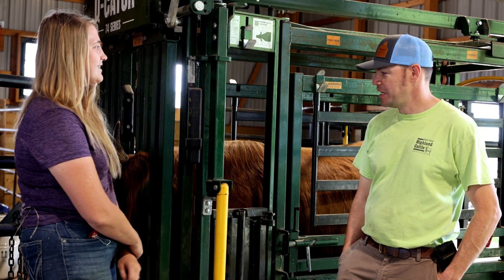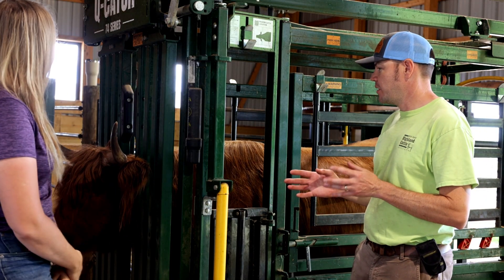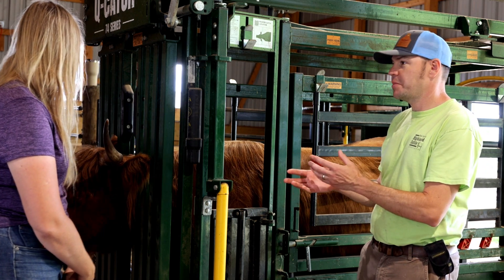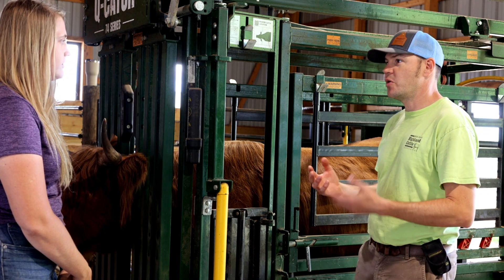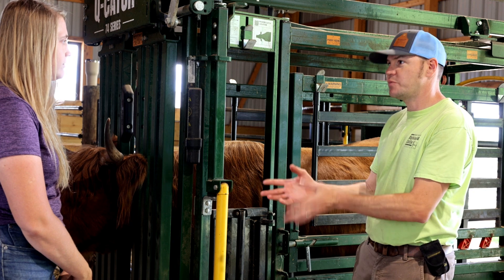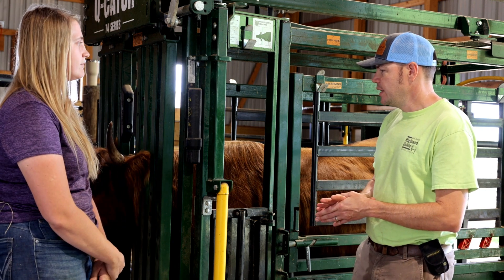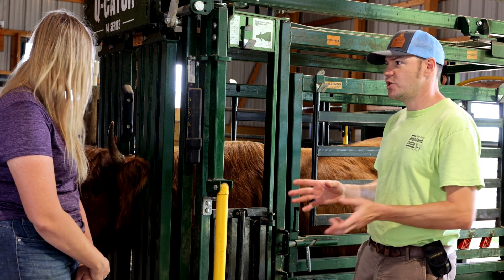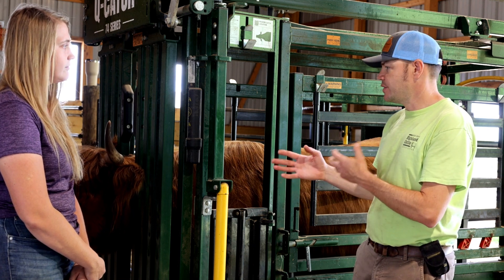This is Juul. So flushing means that we're going to super-ovulate the cow, then we're going to artificially inseminate, and then we're going to take those embryos out. There are different types of embryo creation, and in this case that's what flushing refers to. What we did with Juul is we first started by synchronizing her up, just like we would synchronize a cow that we're trying to breed for heat and AI.